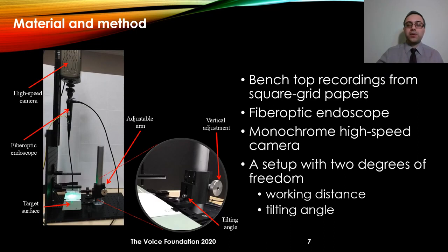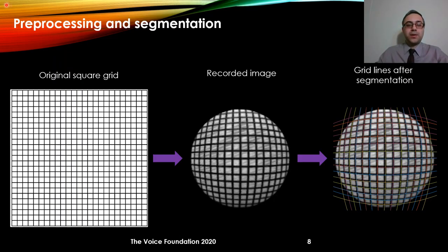To answer these research questions we are using a set of benchtop recordings. A high-speed camera is connected to a flexible fiber optic endoscope. An adjustable arm moves in the up and down direction, changing the distance between the target surface and the tip of the endoscope — we call that working distance in this study. The setup also allows the target surface to be tilted, so the angle between the endoscope and the target surface can be changed — we call that the tilting angle. We use a set of calibrated square grids as the target surface. We then applied an automatic method for segmentation of all the lines, and this figure is showing the result of that segmentation.